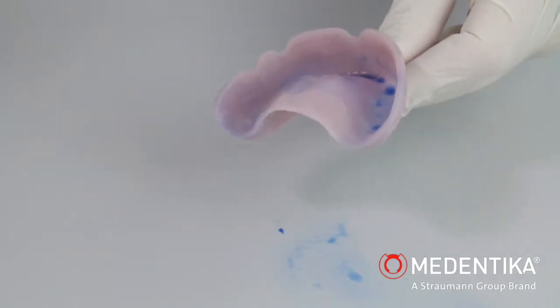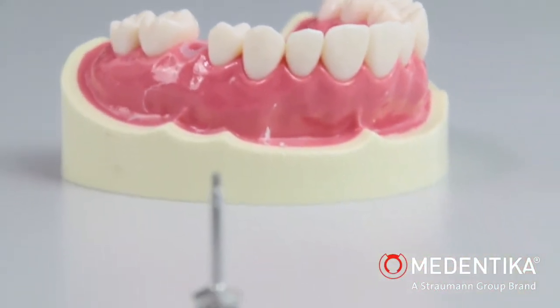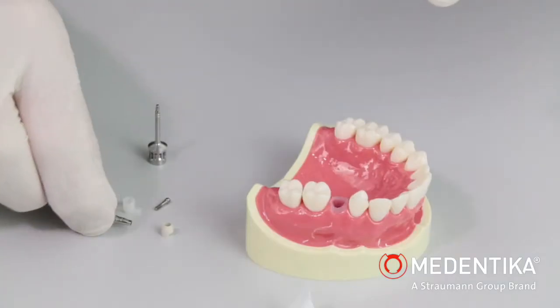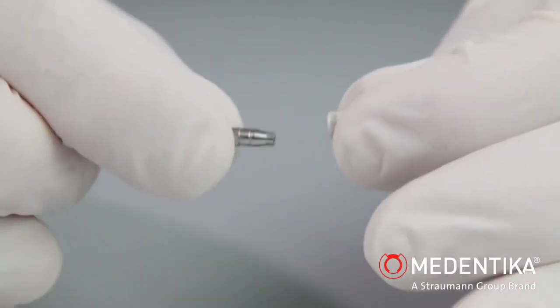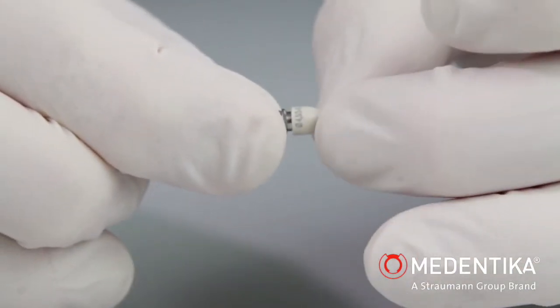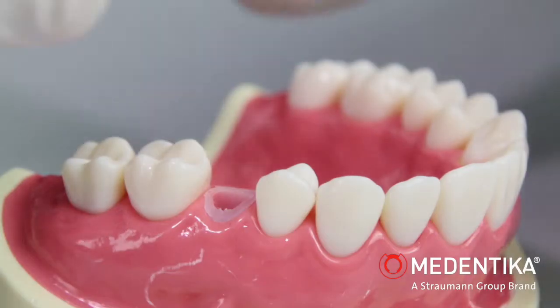We select the custom implant pickup for the transfer for the closed impression. The attachable emergence profile here differs from other commercially available implant pickups. The emergence profile is available in different diameters and gingival heights. A systemic match is guaranteed between the gingiva former used for healing and the emergence profile.